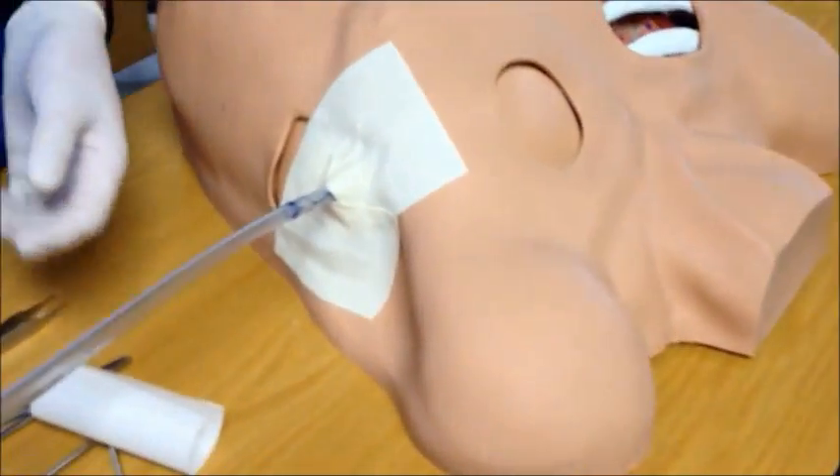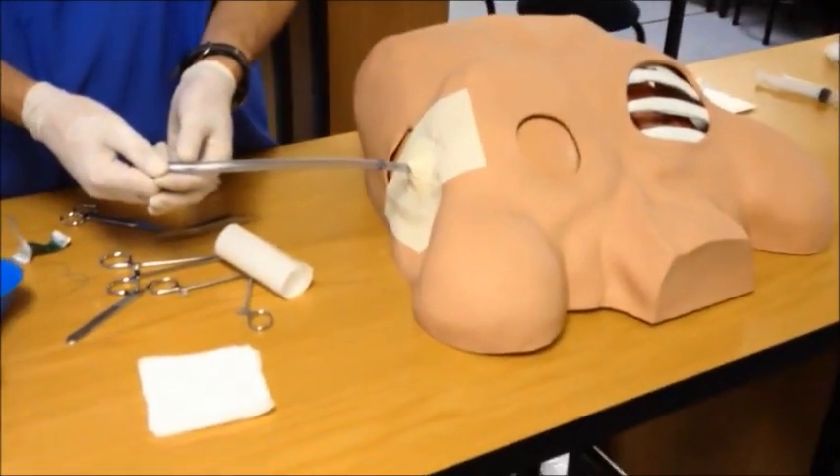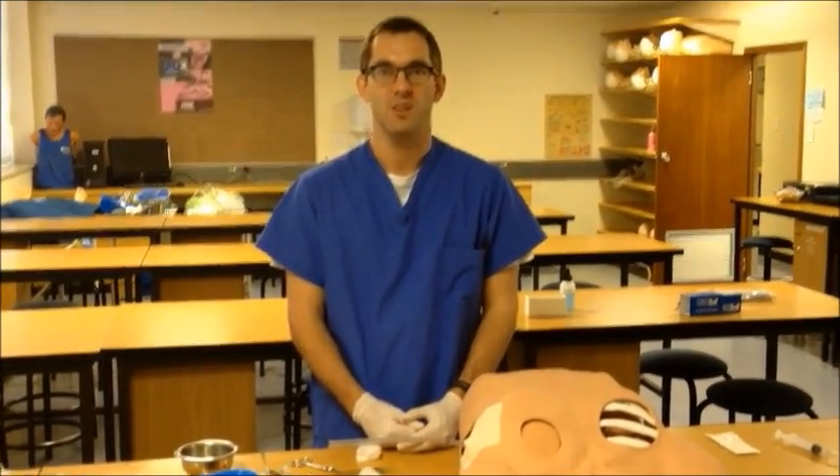Keep in mind that although the drainage box was not connected for demonstration purposes, it should be connected in the real situation. At this point, you would proceed with confirmation of the position of the tube with a chest x-ray and standard post-chest-drain care. And that's it — thank you very much.